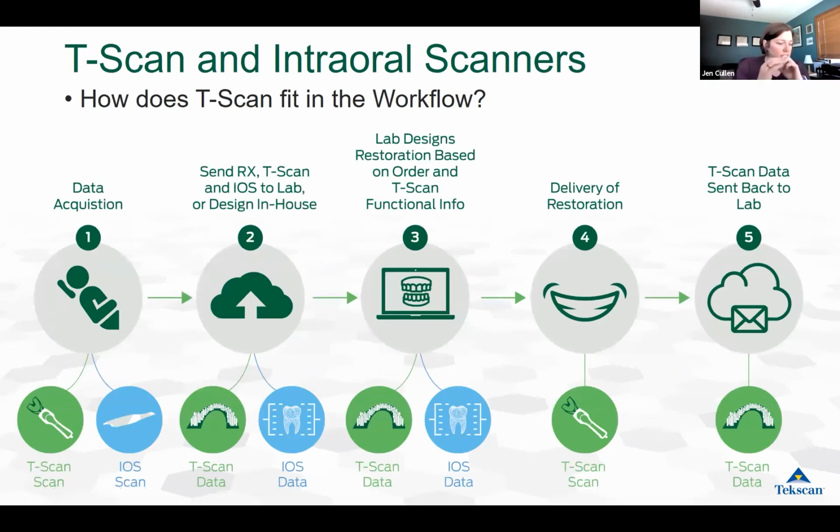explain the differences here, but essentially, intraoral scanners, they're ideal for visualizing the occlusal clearance when designing your restorations. And so some of them have virtual articulation. And what it does is it calculates the dimensions of the interocclusal contacts. And that's extremely helpful in the restorative design process. But what it doesn't give you is the actual occlusal force information or that patient's functional data as the patient closes and slides right and left, what's happening with the forces on the teeth during that time. And so that's where those two things differ.